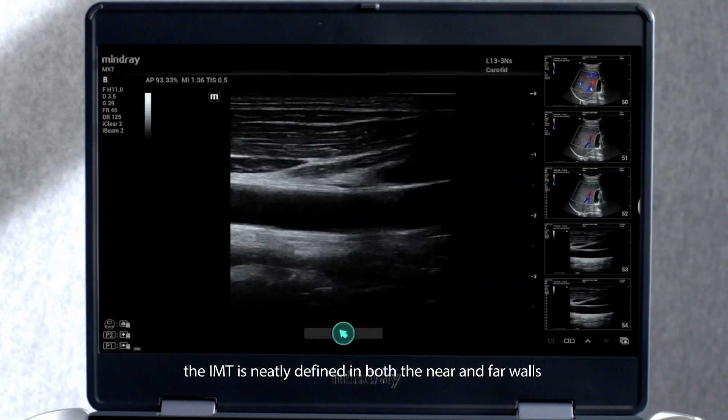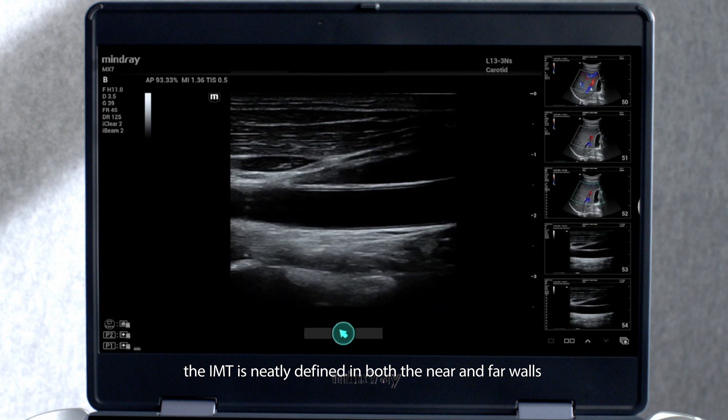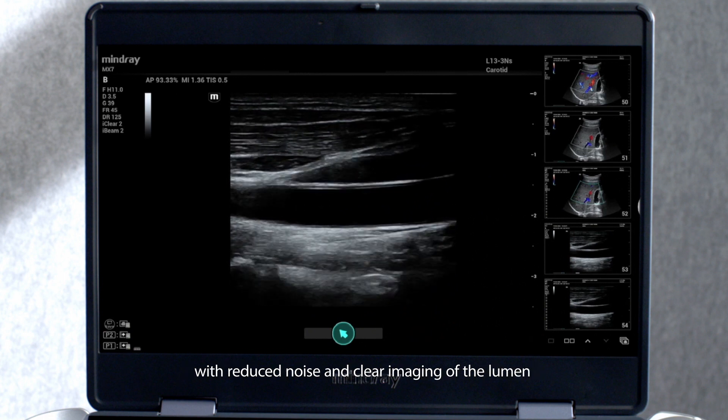The IMT is neatly defined in both the near and far walls, with reduced noise and clear imaging of the lumen.